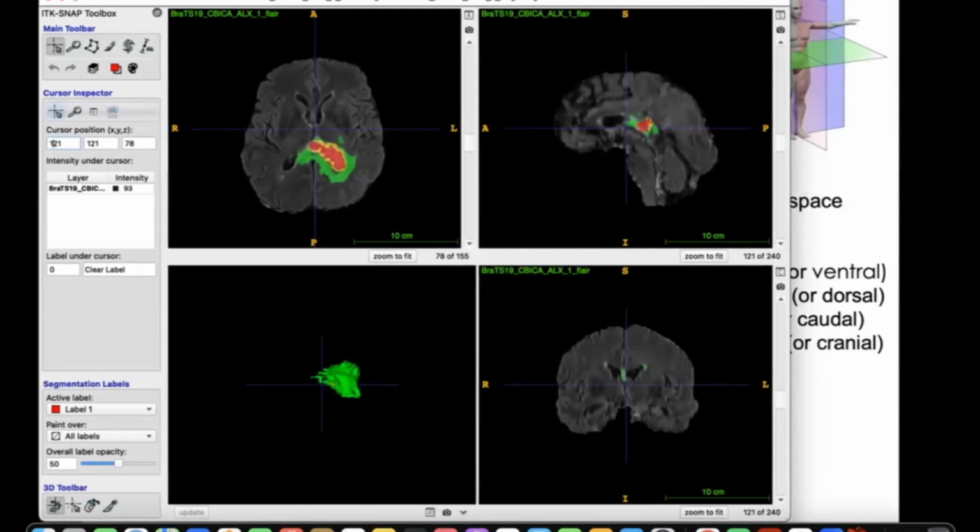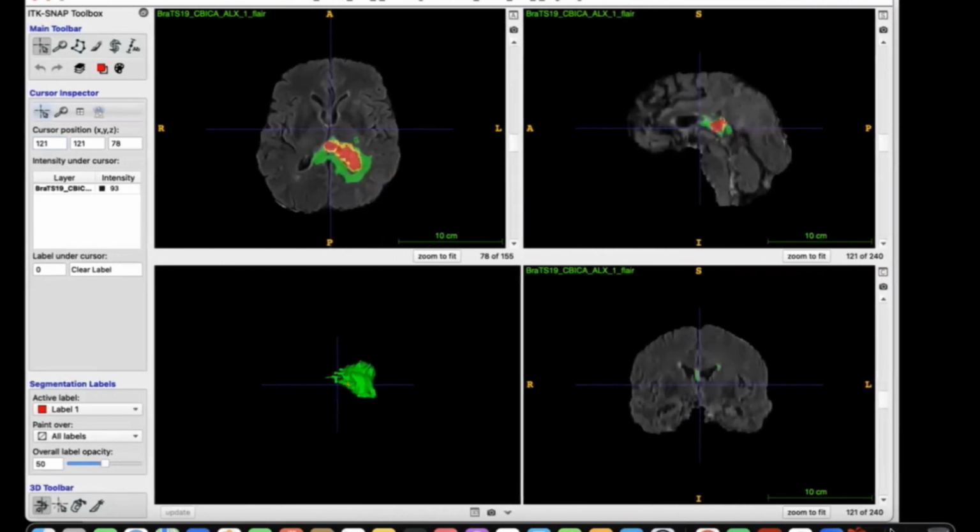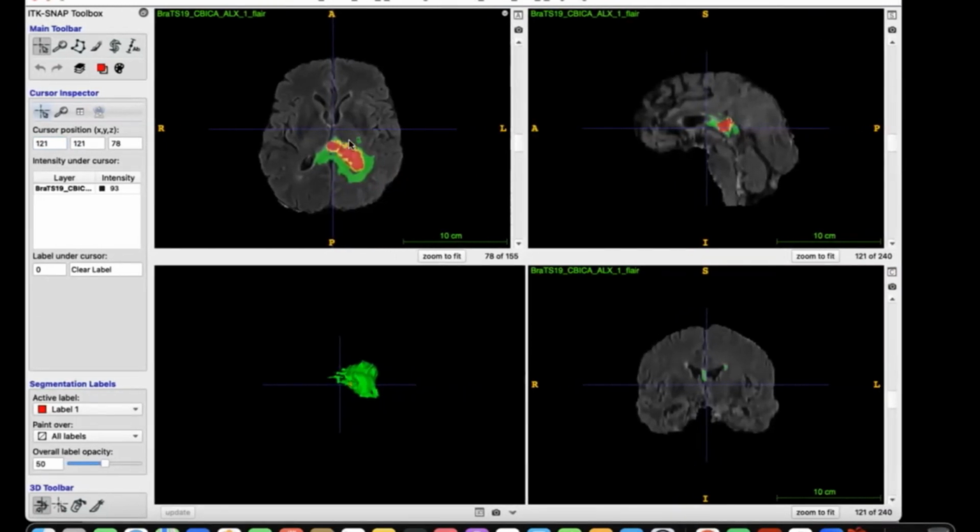Okay. So I don't know if you guys noticed, right? Before we load the map, we can actually see some part in this FLAIR sequence, right? There is some white, bright color in this region, right? And it turns out this is actually the tumor region, as we saw in that video, right? As mentioned, the FLAIR is good at detecting some of the pathology, so it can show some of the disease like tumor here. So these different colors correspond to different tumor types.